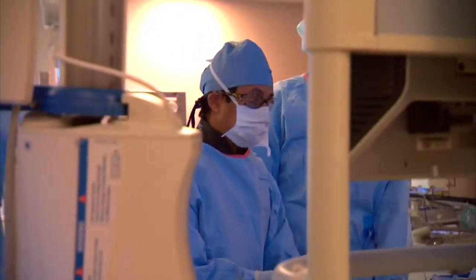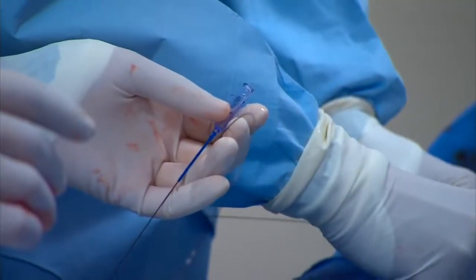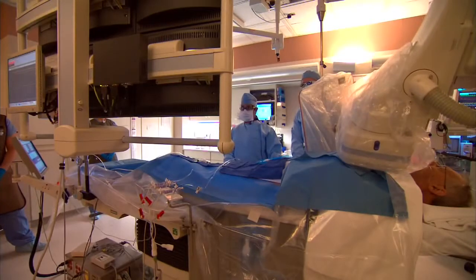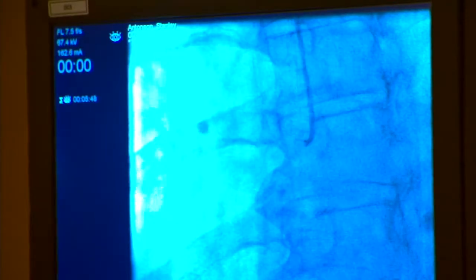Dr. Rajiv Gulati says most of those stents were placed the traditional way, via the femoral artery. The downside of that has been that patients will often need to lie flat for a number of hours after the procedure because there is a risk of the femoral artery bleeding because it's under high pressure. And we need to allow the vessel to heal up before we can have the patient move around.